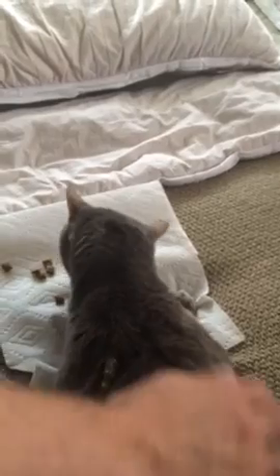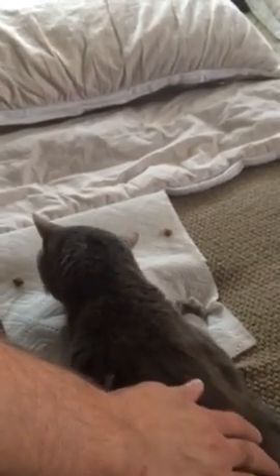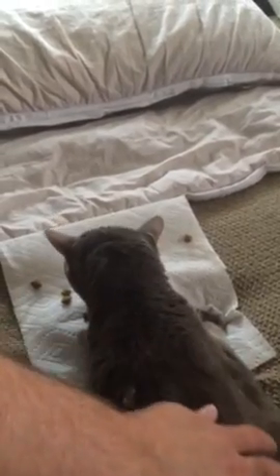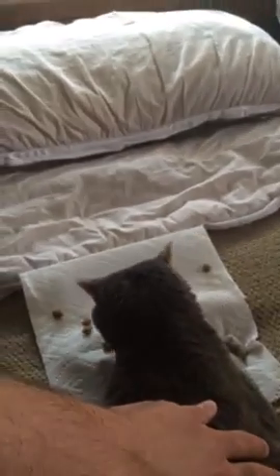I usually keep a hand on him, but when he's eating he's usually pretty still — though you should still keep hold because he can run away. We're already at one and a half, so we're going to be done pretty soon.